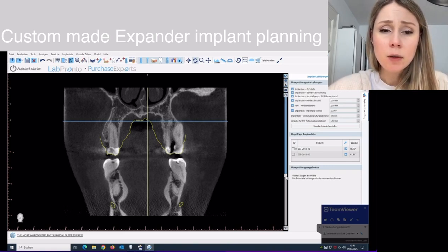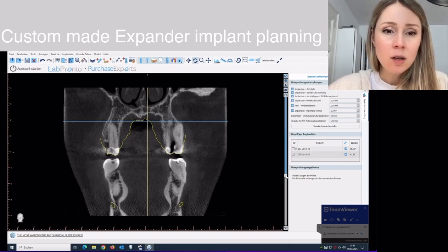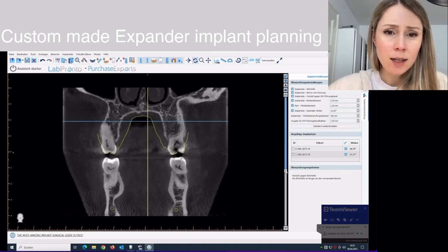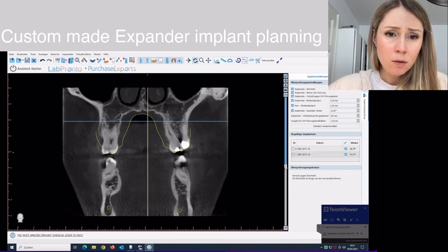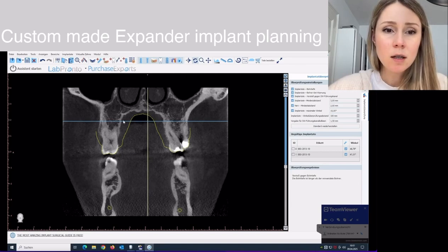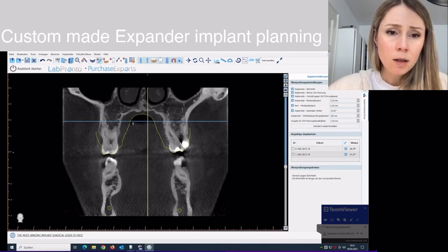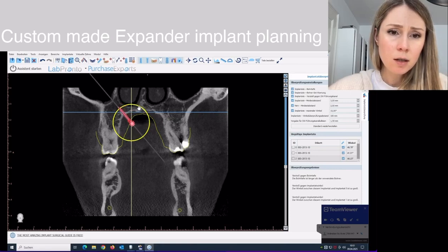So when I'm going here, the problem is that the soft tissue is really thick, so a lot of the screw will just be in the soft tissue. If I'm going slightly further back, it's improving. So if we're between the roots of the 5 and the 6, let's try to place a TAD here, 13mm, and now we're placing it oblique, pointing towards the sinus.